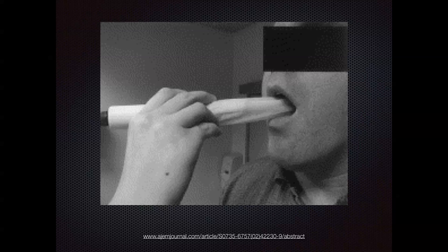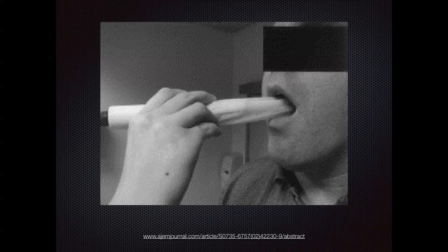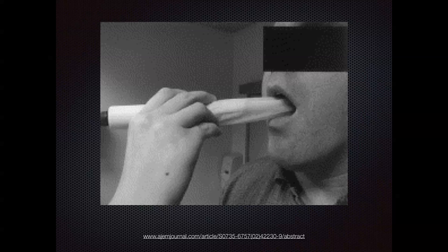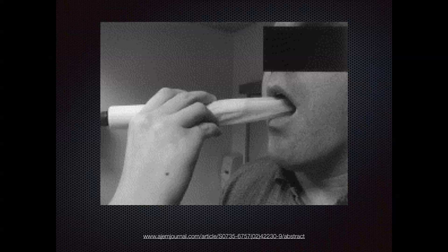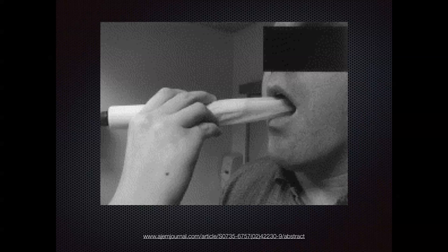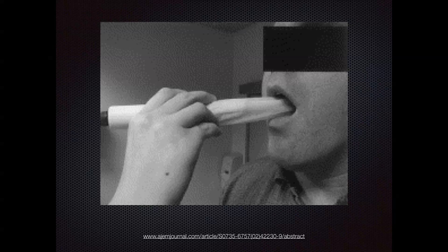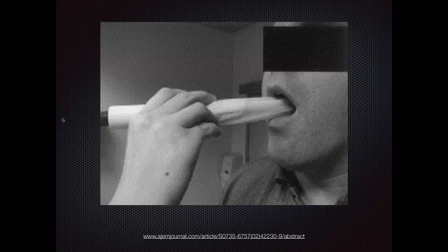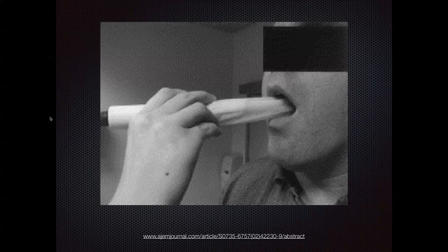Normally what I do is I grab an endocavitary probe — not a transvaginal probe. You never want to say that around a person. Never say 'I'm about to stick the transvaginal probe in your mouth.' Make sure you cover up the probe appropriately and then you place the probe inside the patient's mouth — or actually sometimes I've had them place it in their own mouth — and place the end of the probe right up against where the swelling is.